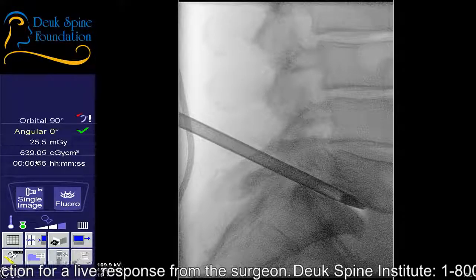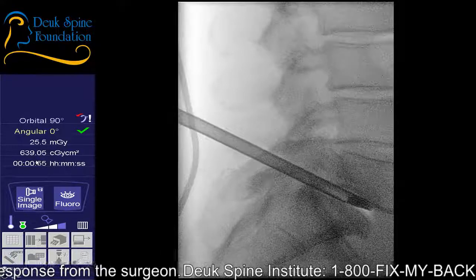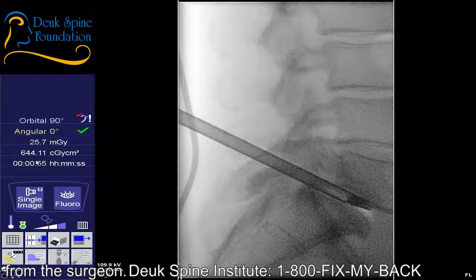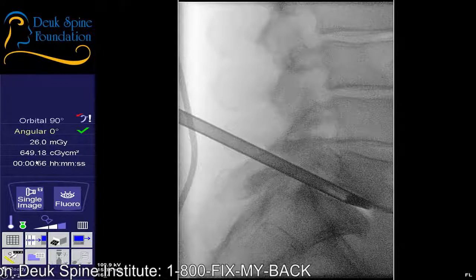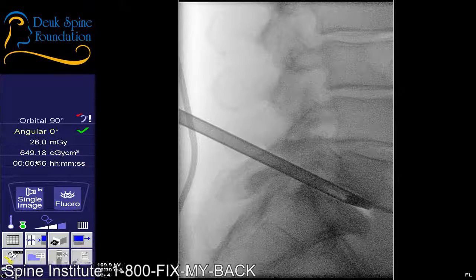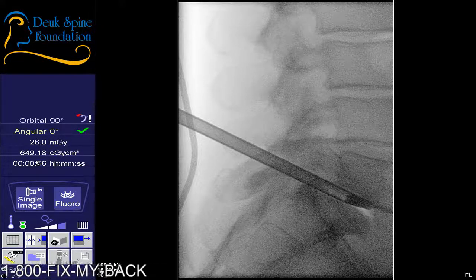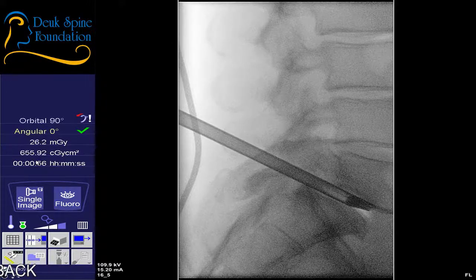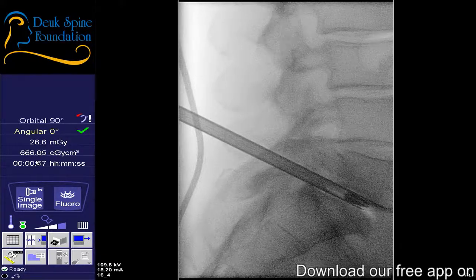It's just wedged in there, and it's causing them to, I don't know what you call it, a cold welding, where they act as though they're one. Which they're not. They're obviously two separate instruments. Need to go in a little bit more. I'm going to have to pull the dilator back again, because it wants to move forward with the tubular retractor. And I don't want it moving forward. Okay, all right, good. I think we're in.